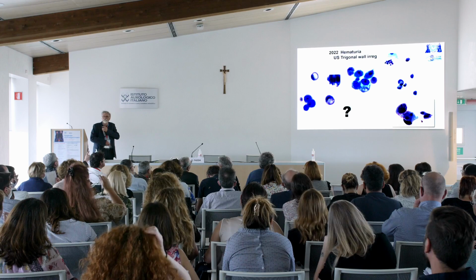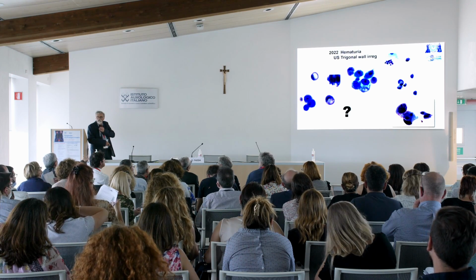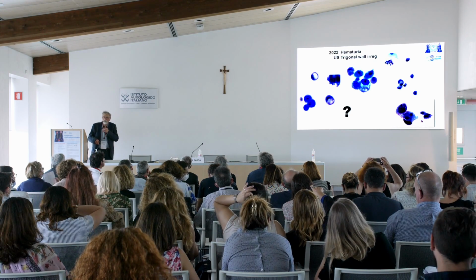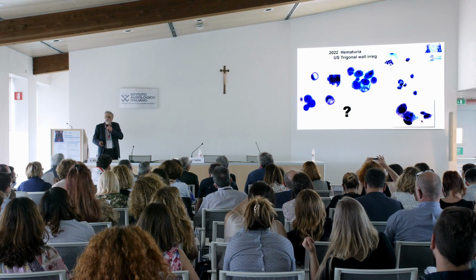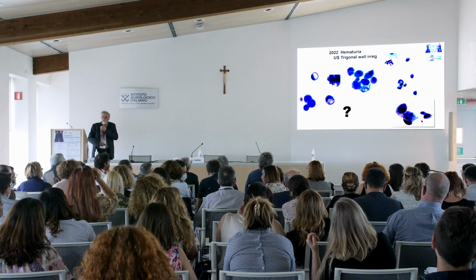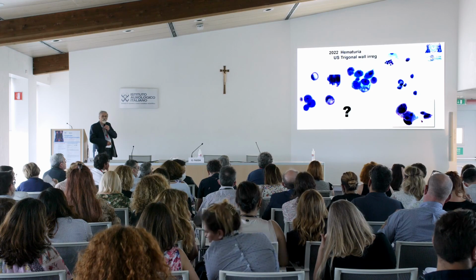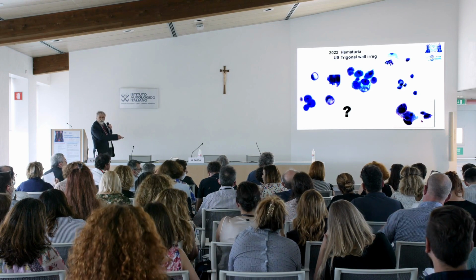But this may happen in the trigonal region. I mean, near a meatus. It was referred by the urologist near a meatus. Trigonal wall, trigonal area. Some ideas? Well, high-grade carcinoma.